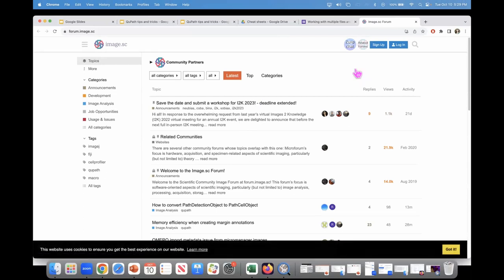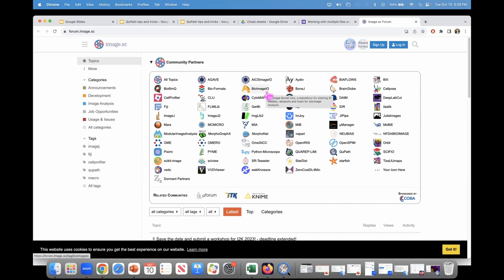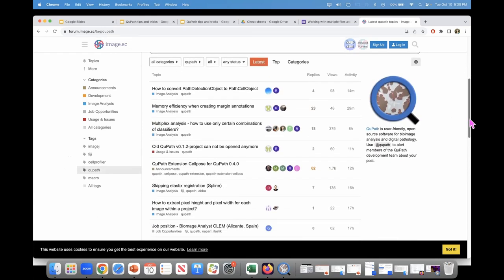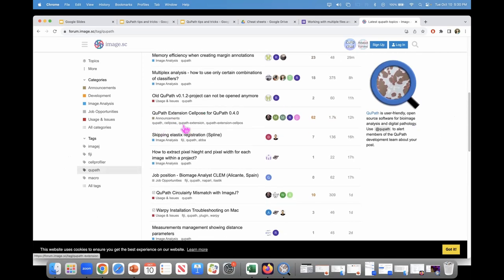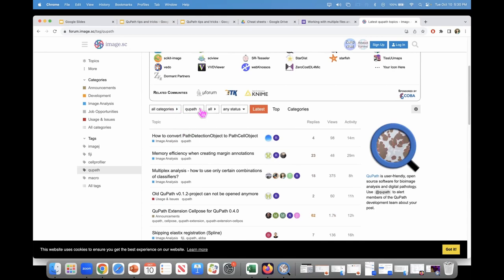If you click on the dropdown for community partners, this will show you a list of all community partners — these are all open source. If you click on QPath you'll get a list of topics specifically tagged QPath — it doesn't mean exclusively tagged QPath, so you can see things like QPath-CellPose, QPath Extension, Fiji, QPath-ABBA. It's just a filter. There are two kinds of filters: the tag itself and the category, so you can filter on things like job opportunities combined with QPath.